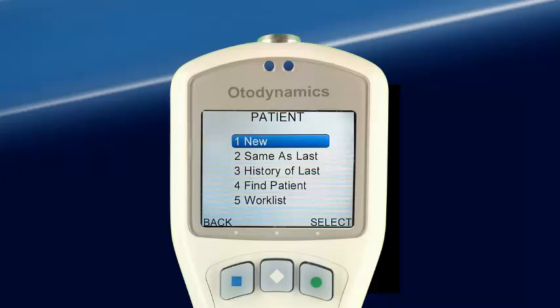Pressing Select brings up the Patient screen. Here we may choose to test a new patient or the previous patient by choosing Same as Last. The other choices — History of Last, Find Patient, and Worklist — can also be used to provide patient data.